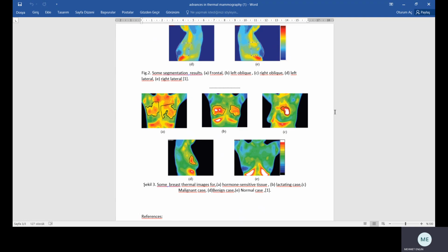In recent years, the use of information technology in healthcare diagnostics is proving to be very effective in improving efficiency and quality of care. Thermography is highly suited for breast cancer screening, owing to its ability to detect cancer much earlier than any other modality, patient safety, and privacy.